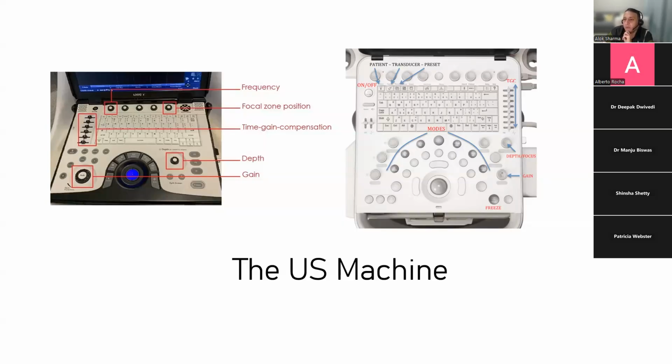Never use a machine on battery. Always connected. Most modern machines are set to work only when you really connect them to an electricity source. But there are some machines that you can disconnect and continue to perform ultrasounds. And if your battery is low and you lose images, it's just a wasted exercise.